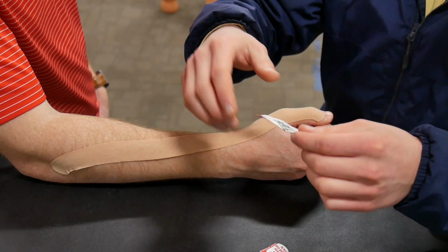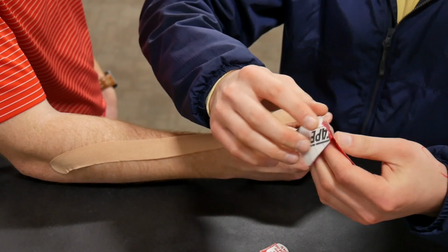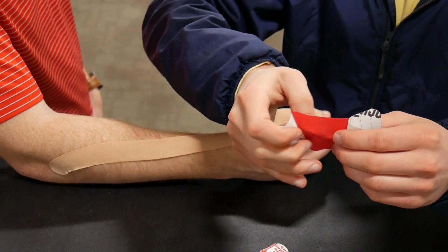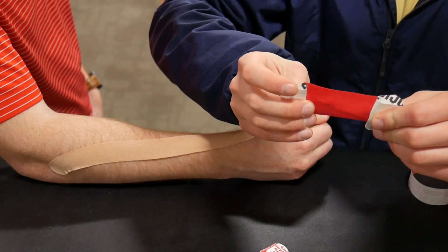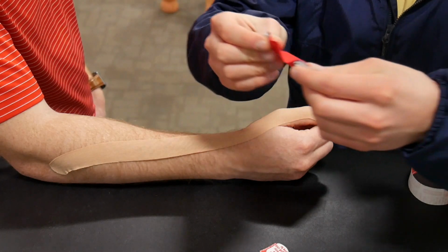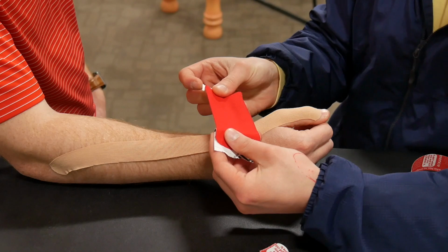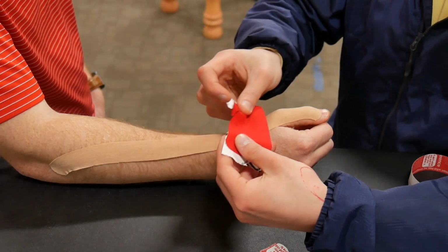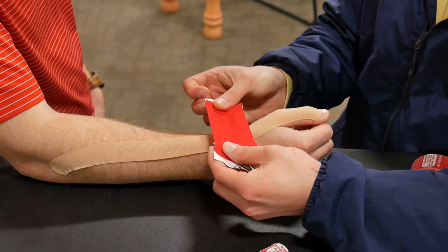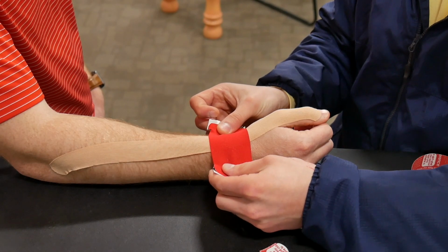Second piece of tape, you're going to come in and tear it right down the middle, and you're going to hold the paper, kind of peel the paper back, and hold each end. And on this one you want to put about a 75% stretch, so you want to put a pretty good bit of stretch, and the middle of the tape is going to sit right over where they say is most painful, which is typically about the central aspect of the radial side of the wrist, right there, just right over the base of the thumb. And where they tell you that is, put about a 75% stretch, come over that and anchor that.